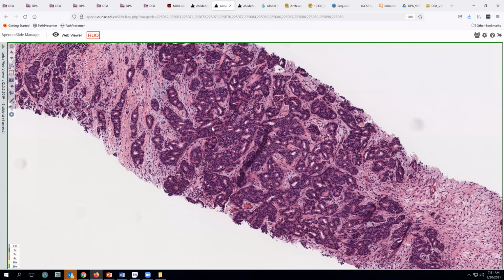And our mitotic index on this case was still fairly low. So this was scored as a grade 2 tumor on the basis of the more solid growth and the nuclear variability and sort of low to intermediate mitotic index.